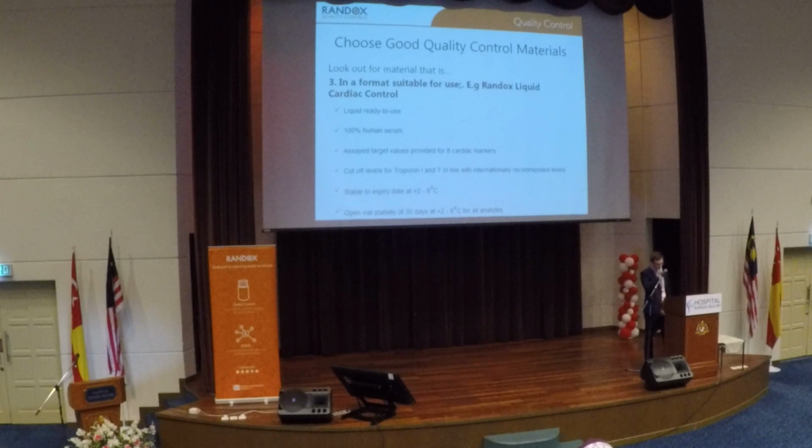So it's important to look out for material that is in a format that is suitable for use. Generally, when it comes to quality control, there are 3 different formats. We have lyophilized, just freeze-dried material, we have liquid frozen, and liquid ready to use.